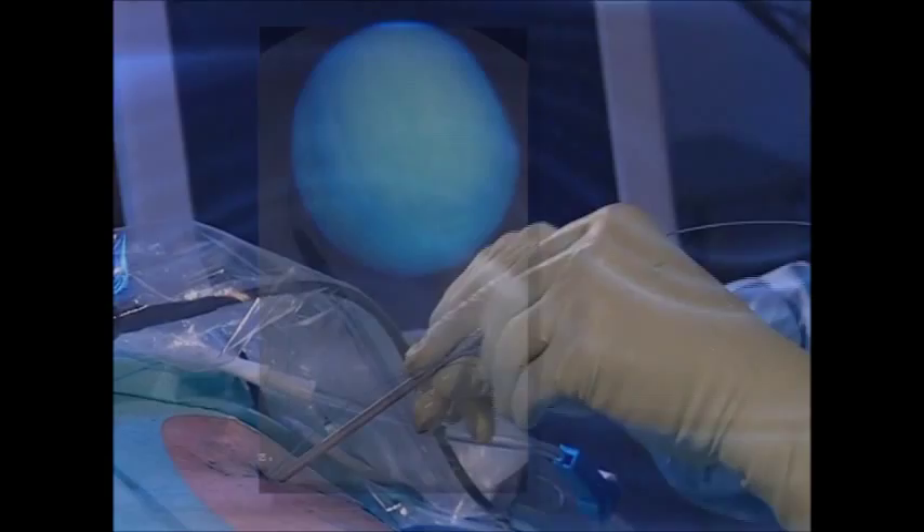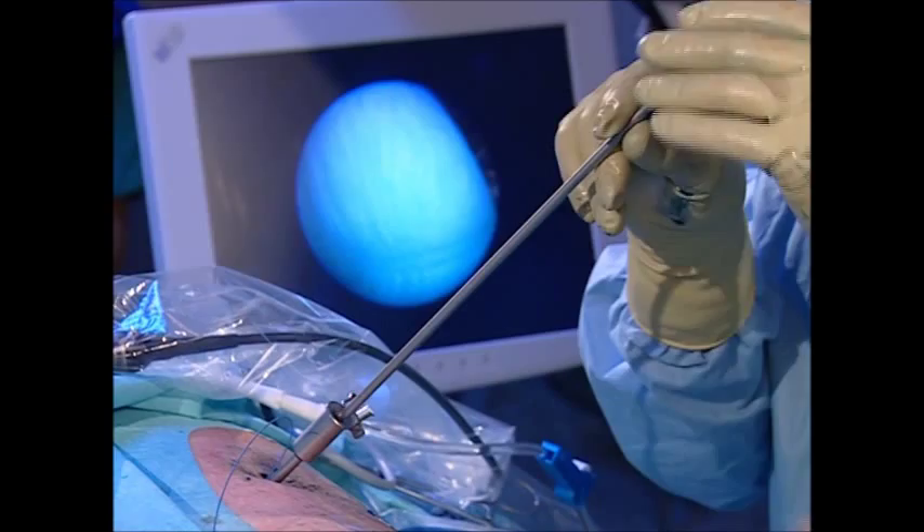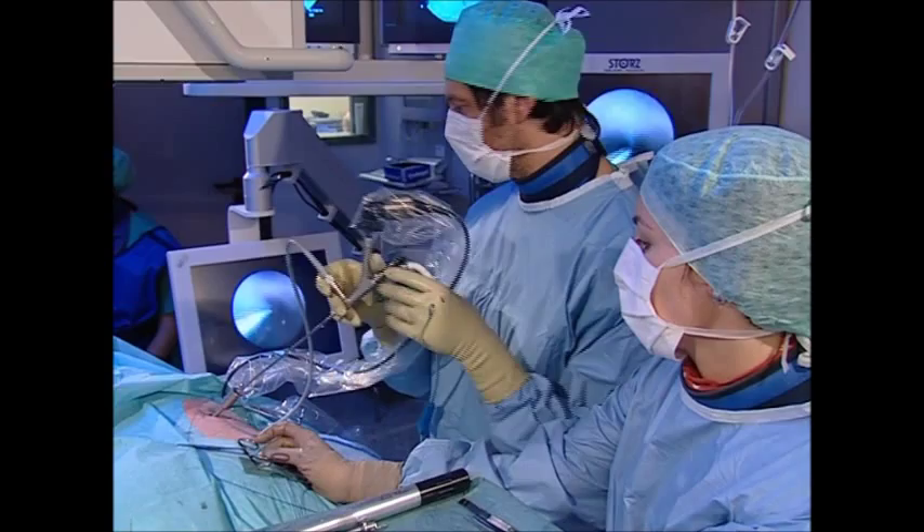The safety wire is now fixed in the access tract between the instrument and the parenchyma and is additionally secured with a clamp. The nephroscope sheath is then placed parallel to the guide wire. Reinsertion of the nephroscope is followed by overview nephroscopy. Attention is then focused on the stone.